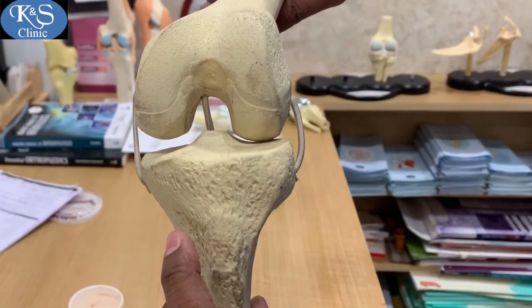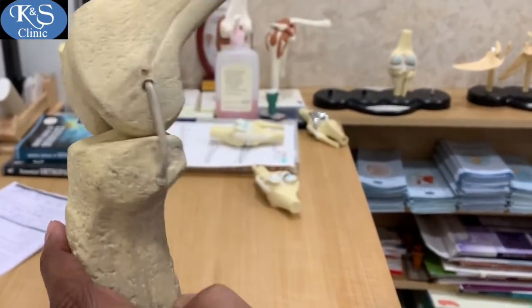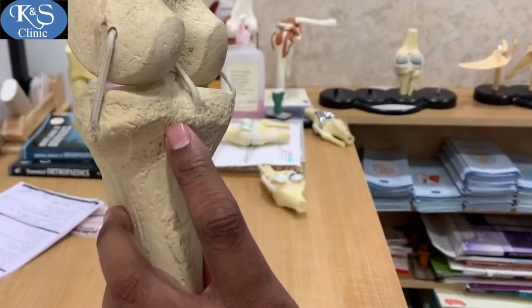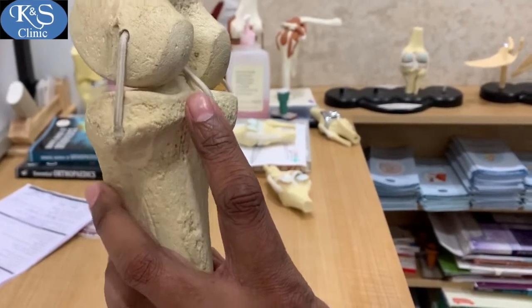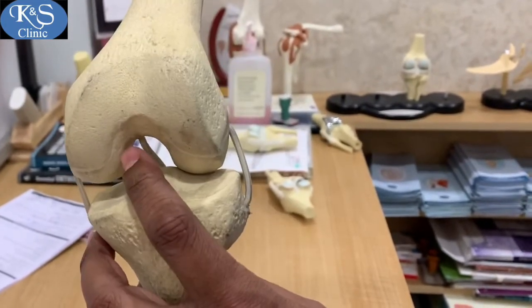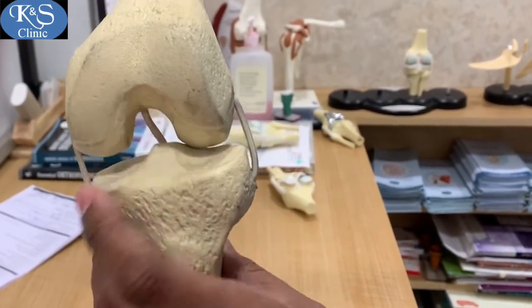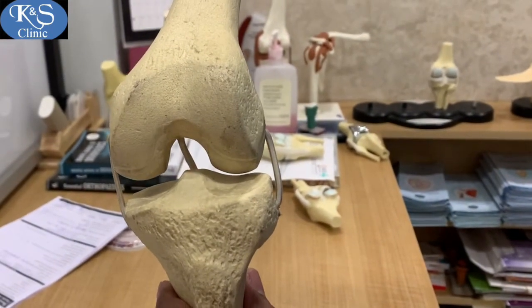The graft is passed from anteromedially, goes all the way backwards, exits through the tibial part of the footprint, and then goes anteriorly through to the medial side of the notch. This is done by delivering two ethybond loops — one from the femoral footprint and the other from the tibial footprint.